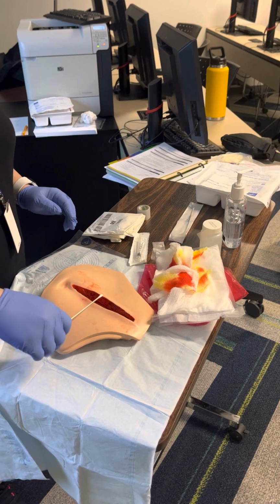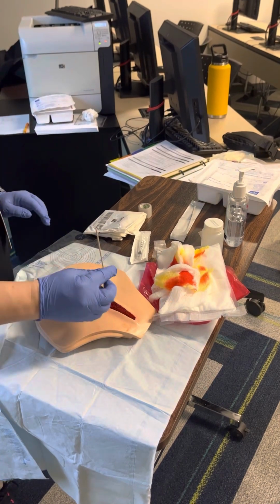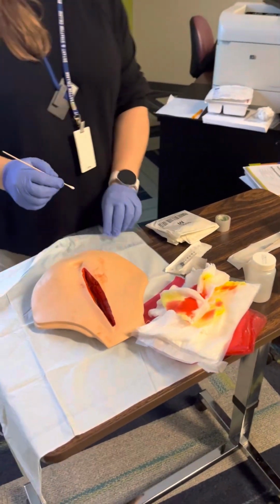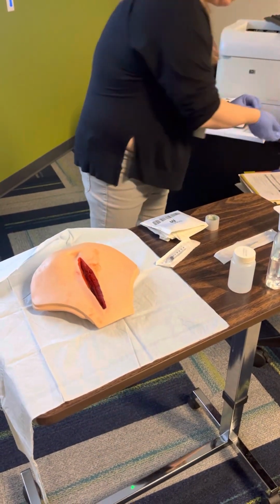I'm gonna go across for width. And I get 2.7. I'm gonna go in the middle for depth. And I get 3.1. All of this is garbage. Take this to the side. I'm gonna take off my gloves.